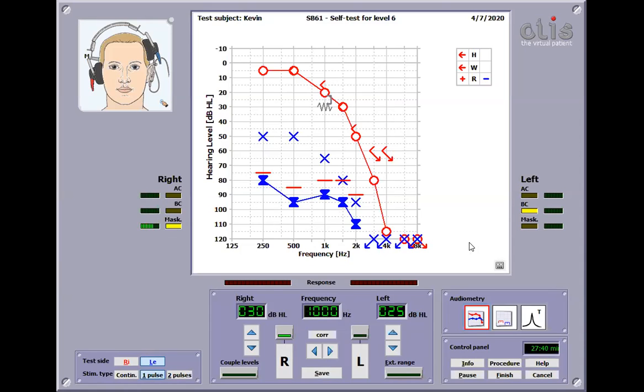I'm not going to explain the occlusion effect and why we have to reestablish the threshold, but I'm sure your teachers will let you know. I didn't because I've completely forgotten why they are related. But yeah, just reestablish the threshold.